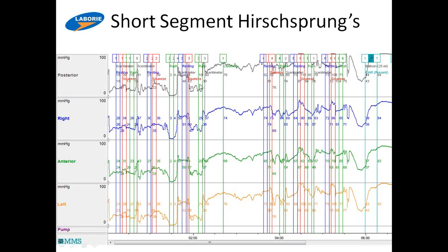So we go over here and you see the baseline goes way up at about 4. Oh, well, here, wait, sorry. Yes, 3 centimeters right there. It goes way up. So again, a 3 centimeter sphincter muscle. Mean maximum rest turned out to be 96. So that's already markedly elevated. What's normal? 30 to 40. Hey, I wouldn't quibble about 50 or 60 in a patient that was functioning normally, but 96, you've got to think, hey, that's a lot of pressure there.